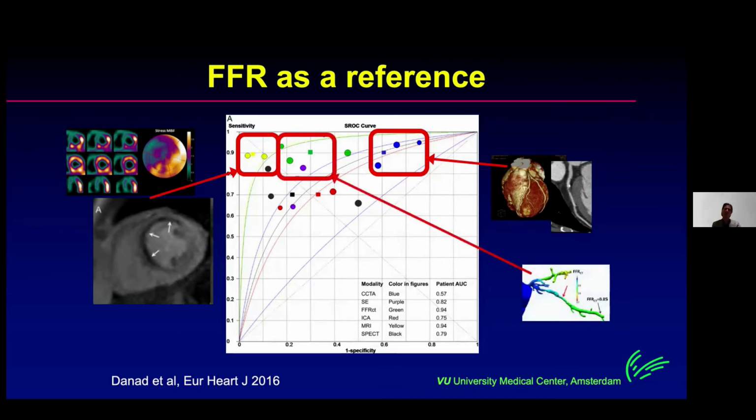But at that time, when you included FFRCT, it seemed to become pretty close to functional imaging alone.